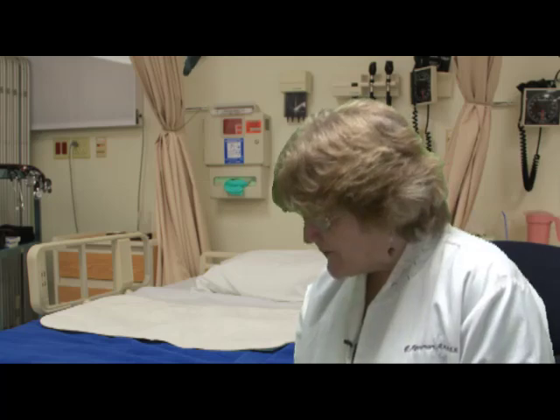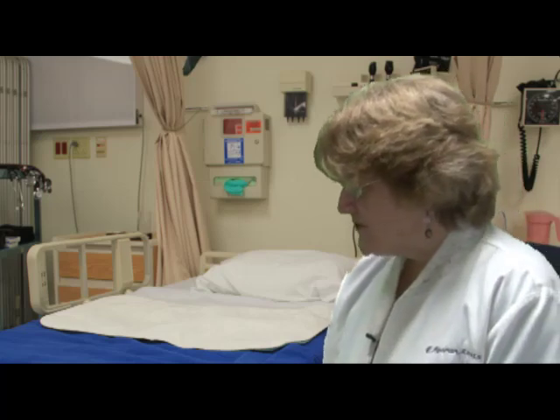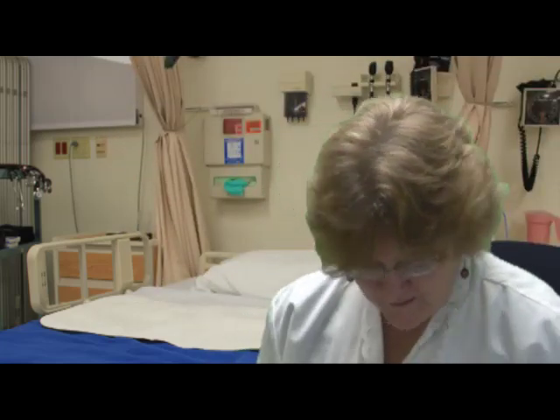Can I call you Lita? Today I'm going to look at your head, your eyes, your ears, your nose, and your throat. To do this exam I'm going to need inspection, and I'll also need an ophthalmoscope and an otoscope. You can get those either on the wall or use a portable one that you have to put together, as we do in some clinics.